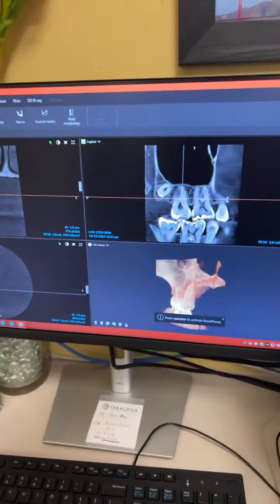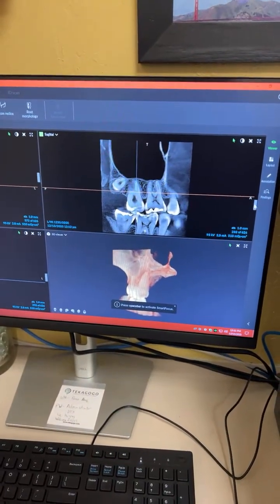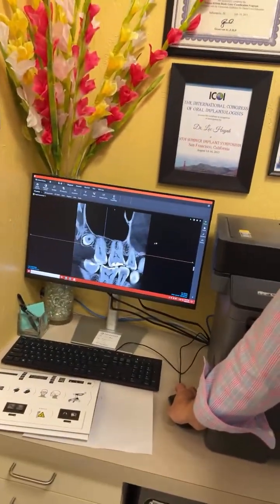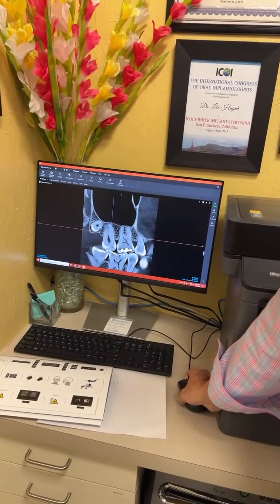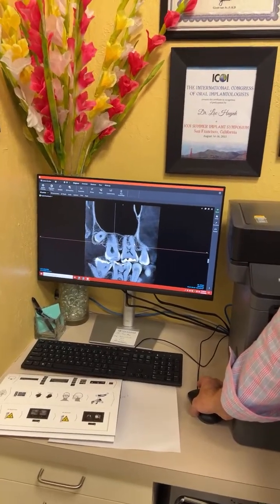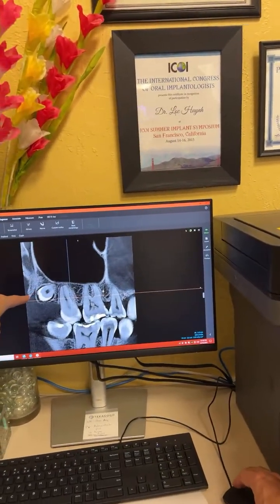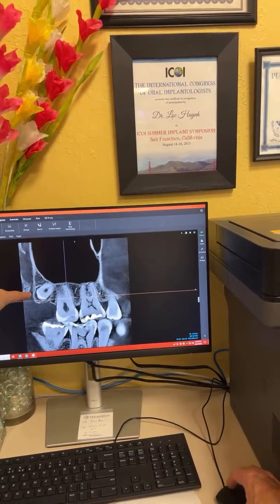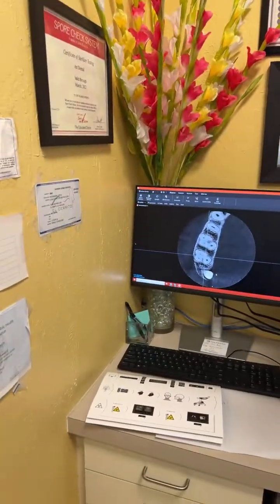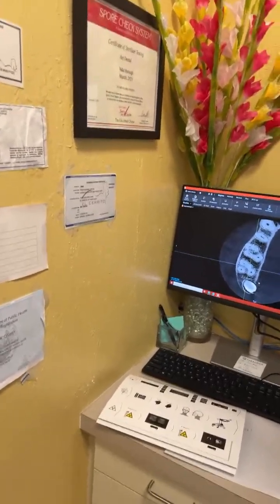The preview. Your wisdom tooth baby is still right there, not coming out. You can double click this if you want. Yeah, I love this. You still have a baby tooth. That's nice. This is wisdom tooth number 1. But it's very small, tiny, with short roots. I thought you had like a baby. Yeah, that's the small one. You can also see it here. Yeah, look at that. See the location is actually more on the lingual side.